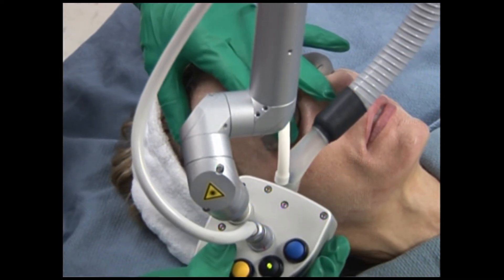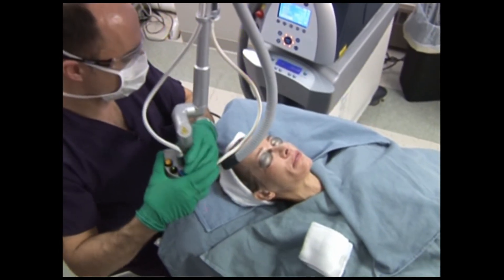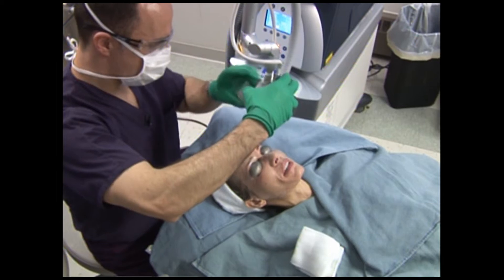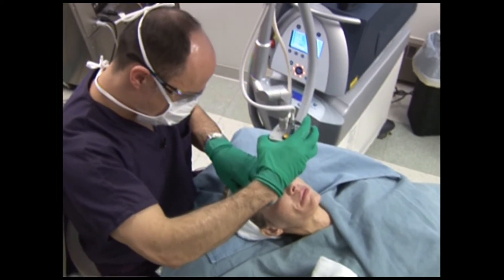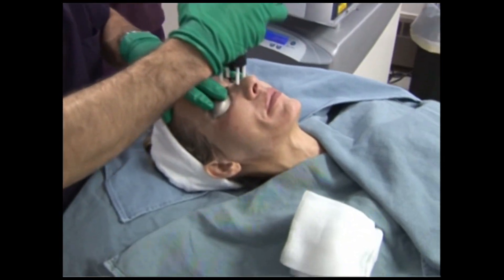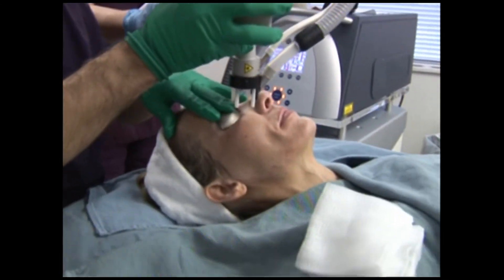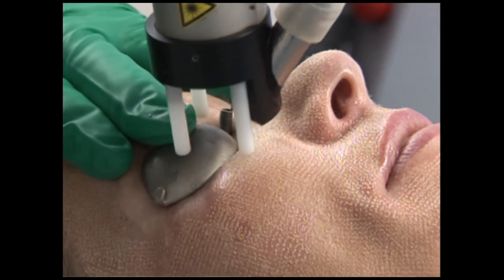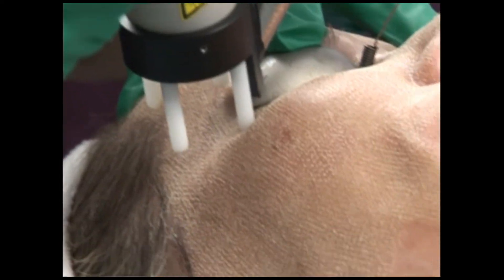Basically, if you're here and going through all the recovery, it's nice to be thorough. I'm going to treat the nose here — is it more sensitive? I'm going to gently press on these eye shields and then come down to your nose. That's tolerable. Good. Going onto the cheek and the crow's foot area.